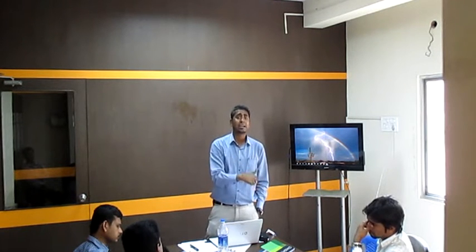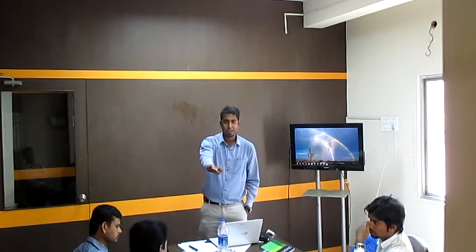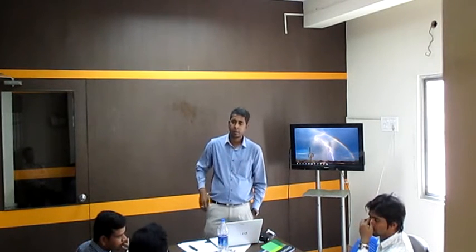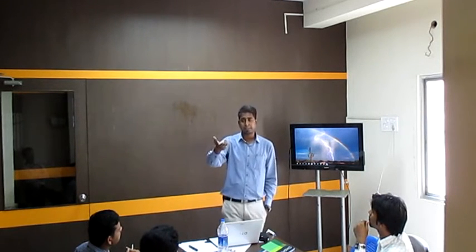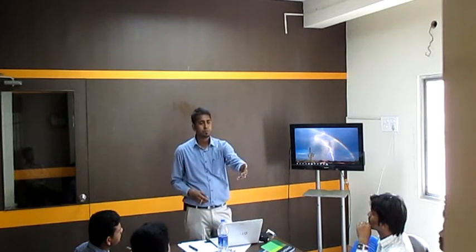Got it? Now we have two types of micromotors: air micromotor and electrical micromotors. Air micromotor will again have a gear based handpiece. So this handpiece is 40 watt, 60 watt. He is talking about what is the watt of the handpiece. Actually, see, what do you mean by power?